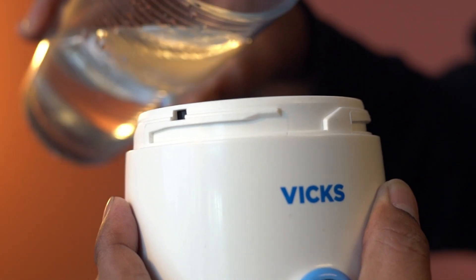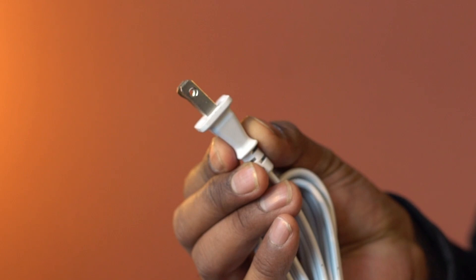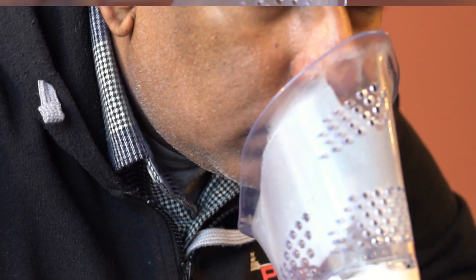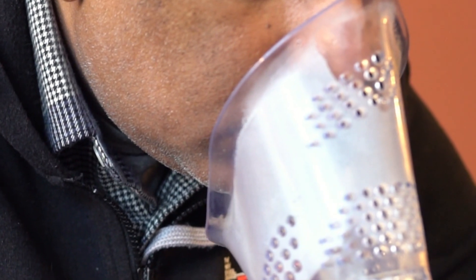Fill the water reservoir with about 40 ml of cool tap water. The green light indicates that the steamer is on. The inhaler takes about 6 minutes to begin making steam. Place your face over the mask and continue for about 5 to 15 minutes.